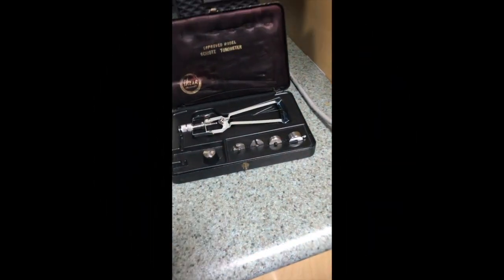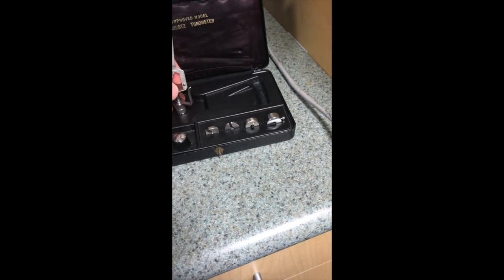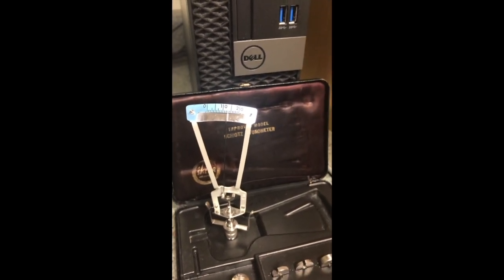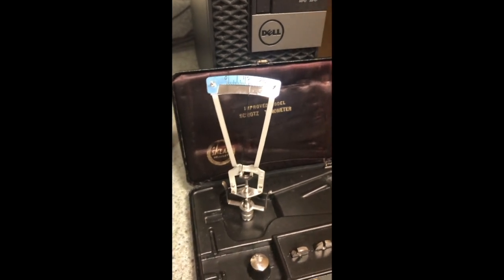You'll open the case and find the actual tonometer here. A couple of important pieces in it. First is the scale that's up top, and that gives you the reading that you'll use on the conversion chart after you assess the pressure in the patient's eye.